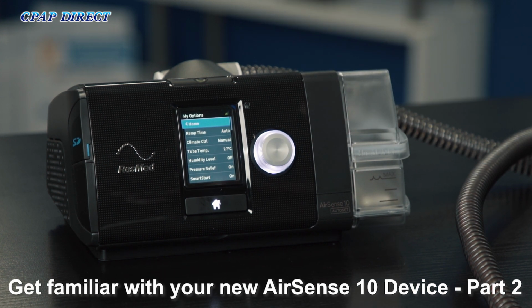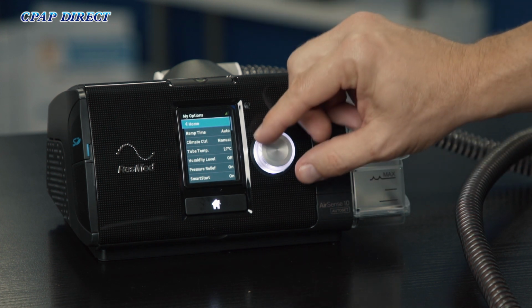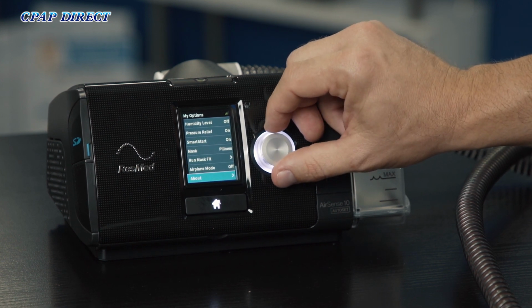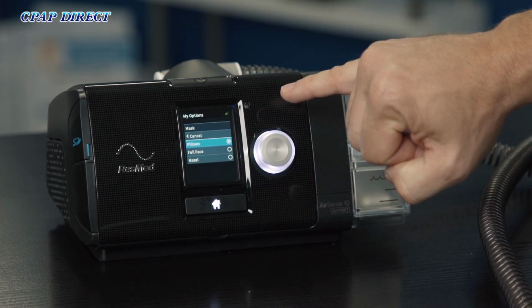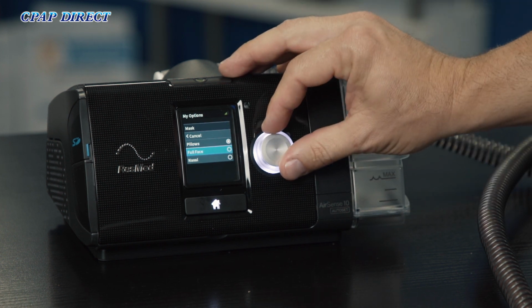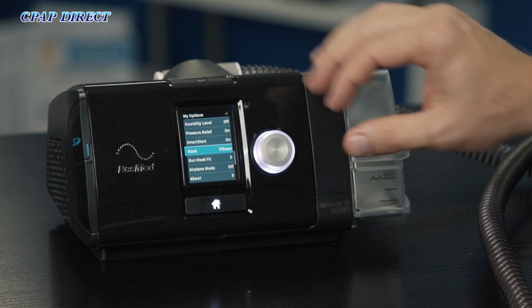So if you have a nasal pillow mask, you want to make sure that the machine knows you've got a nasal pillow mask. If you've got a nasal mask or a full face mask, same again, you need to make sure that it's got the right one locked into the settings. So you can scroll down to the very bottom, to mask, and press the button there to enter. And you can see you have the options there for pillow, full face and nasal, and you can just move it around and lock in the one that you want from there.